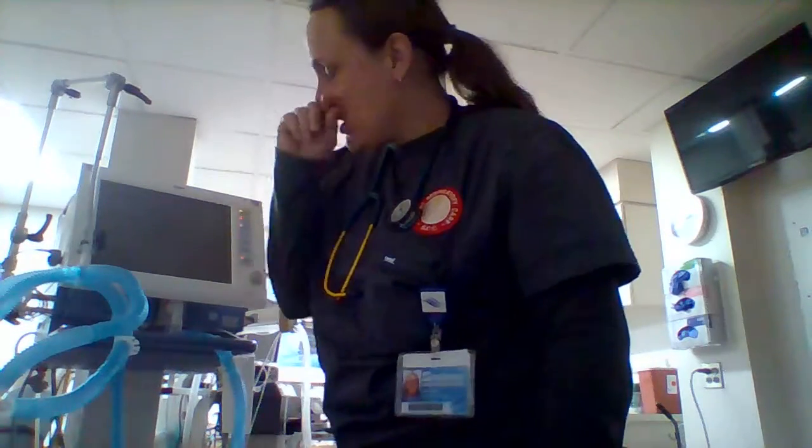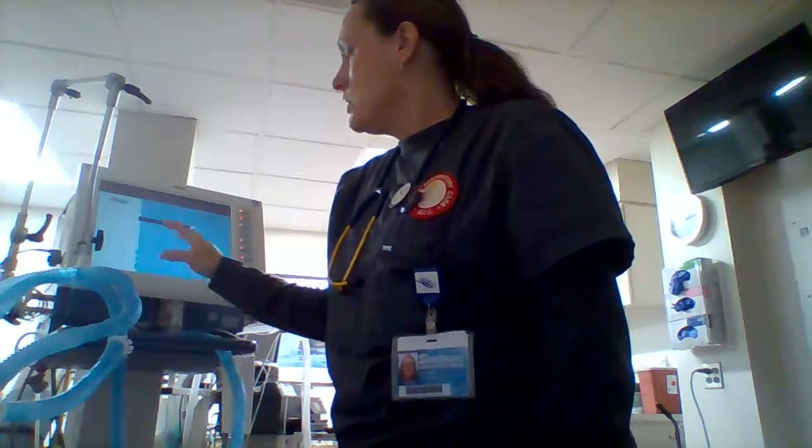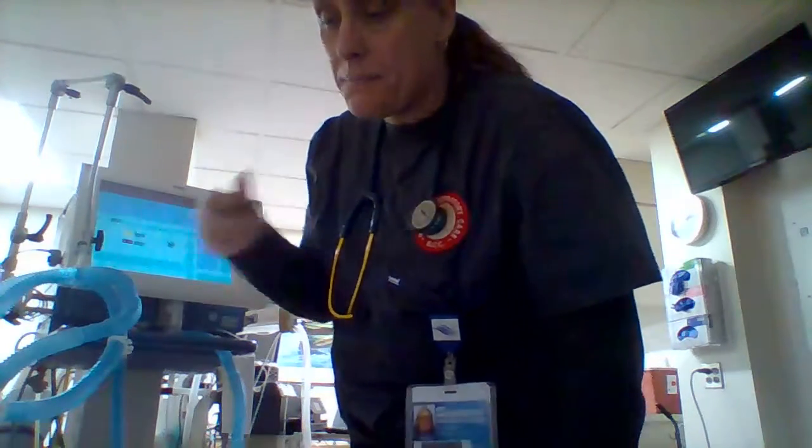It's going to be loud for just a second while I'm setting it up. Here, they automatically have their circuits all hooked up and they've already done all their checks. It takes 2 respiratory therapists to do the check, and then it's covered with a big plastic bag so that you know it's ready to go. And you don't have to do all that in an emergency because that would be bad.